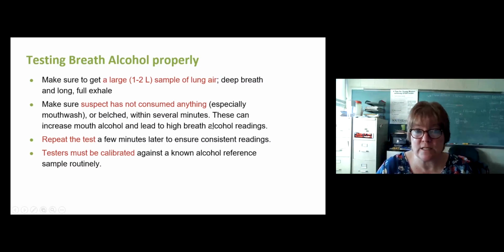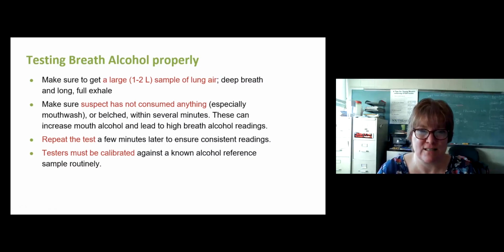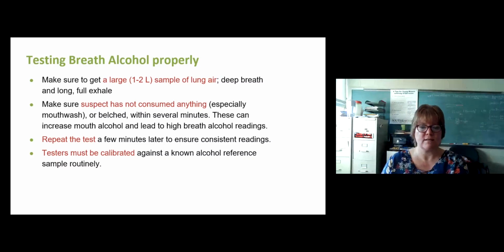So because of both of these things, you want to repeat the test a few minutes later. One test is really not sufficient due to so much variety of things that can happen. Obviously, you don't want people taking tests immediately back to back. They're going to probably pass out. So a test, then a few minutes later, a second test.